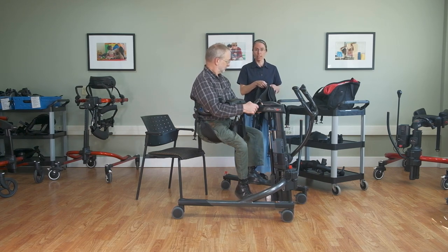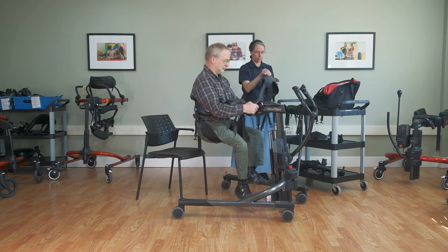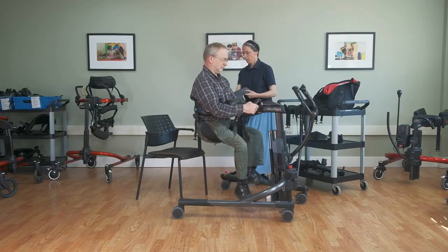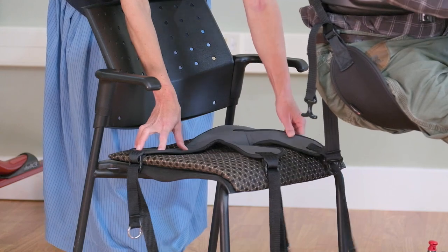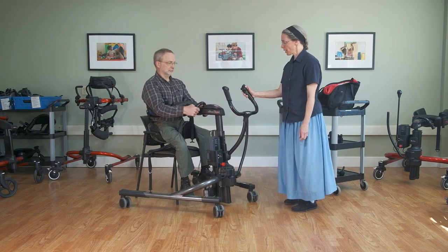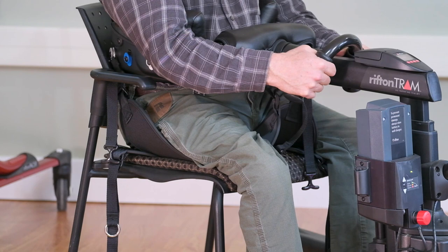For supported ambulation we have three sizes of walking saddle. The straight flat portion goes toward the back of the seat and that's going to do the weight-bearing assist, then the front straps come between the legs. As you're setting it on the seating surface, you don't want it all the way back — you want it a little forward because the ischial tuberosities are what will be supported there. To use the walking function of the TRAM, we need to find a way to get that walking saddle underneath. In some cases you may be able to do a partial supported sit-to-stand and slide it under.